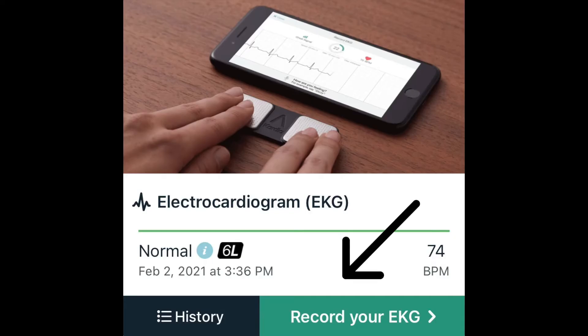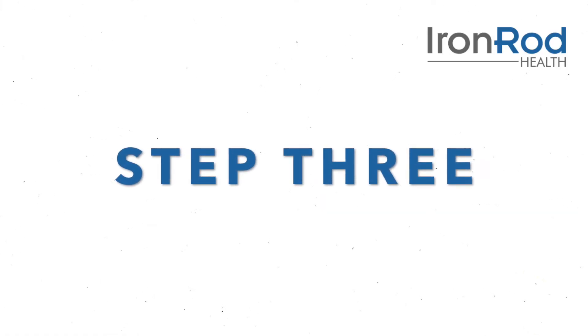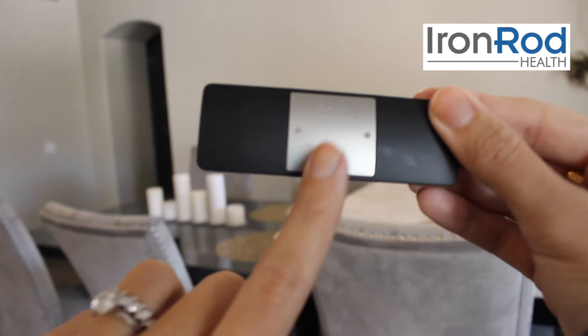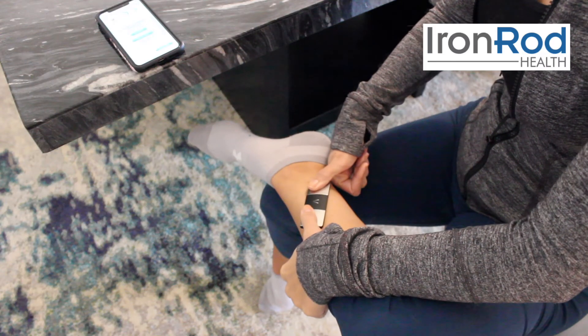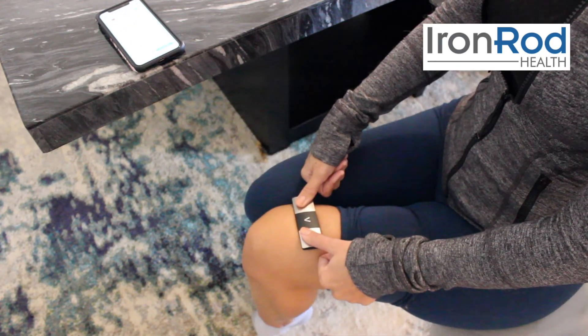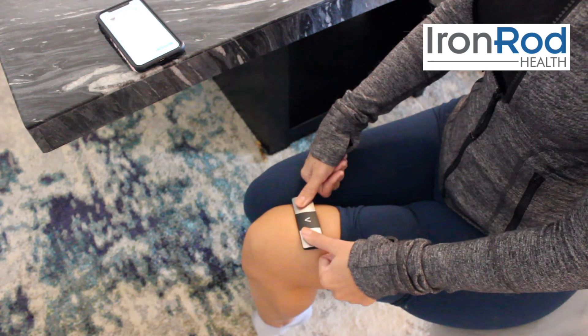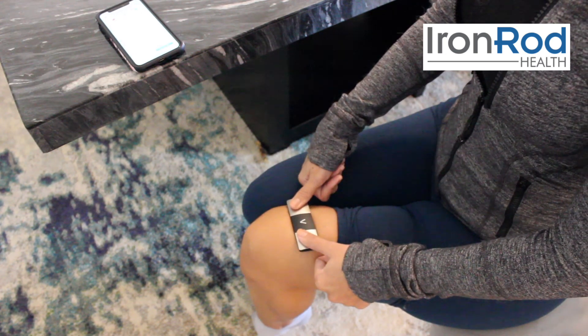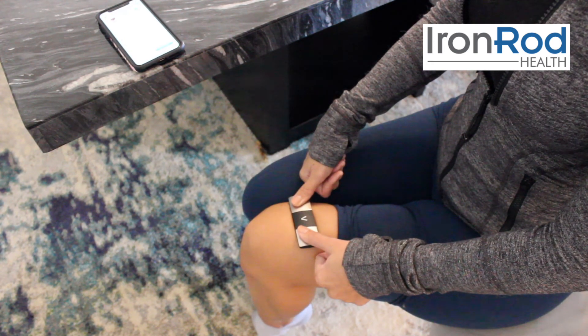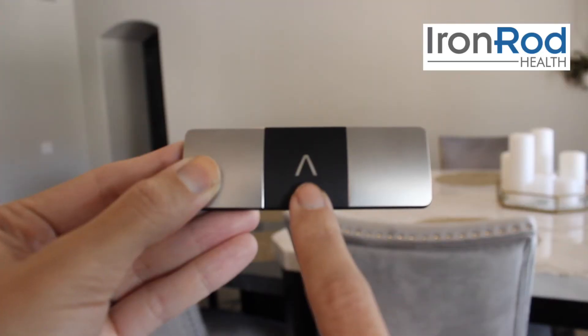Now, find the button that says record your EKG and press it again. To take your EKG, we're going to place the silver electrode on the back of the device on either the inside of your left ankle or just above the top of your left knee. Then place one thumb on each of the electrodes on the front of the device like this.